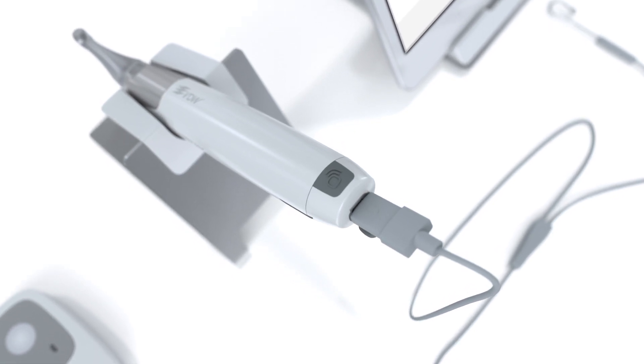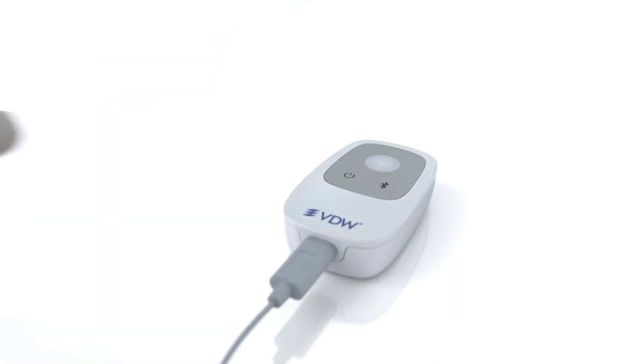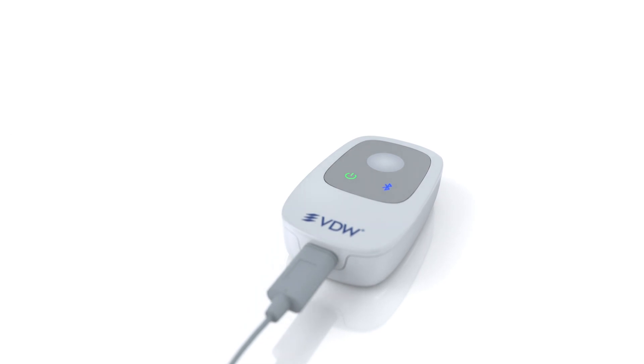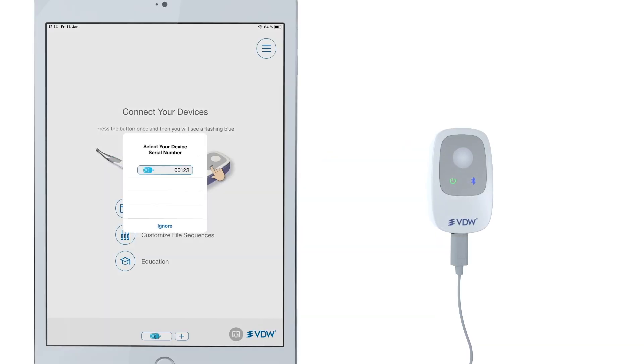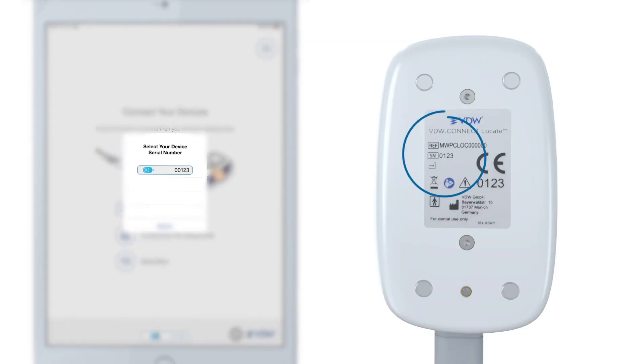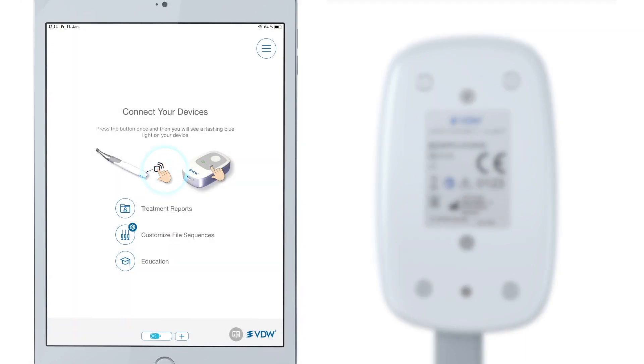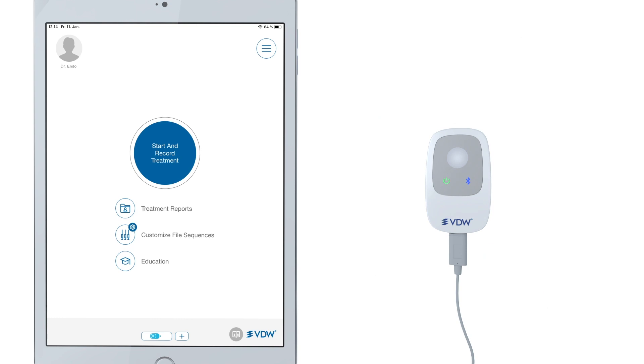Once both devices are connected, turn on the VDW Connect Locate and click on the Bluetooth button next to the Power On button. You will see a serial number pop up on the Connect app screen on your iPad. Double-check with the serial number on the device and then click on Confirm. Your apex locator is now connected.